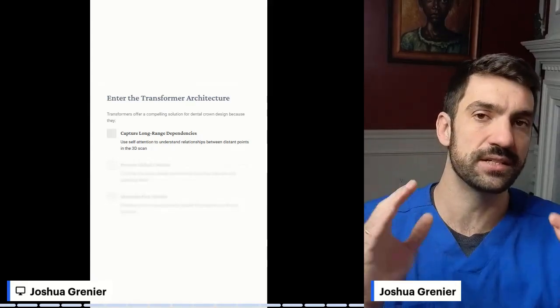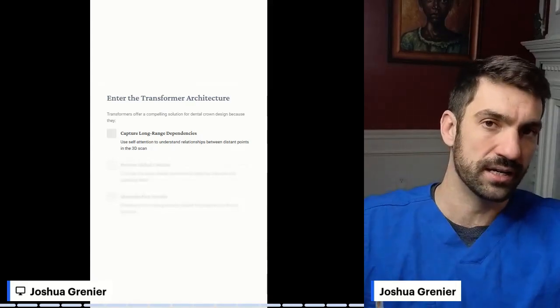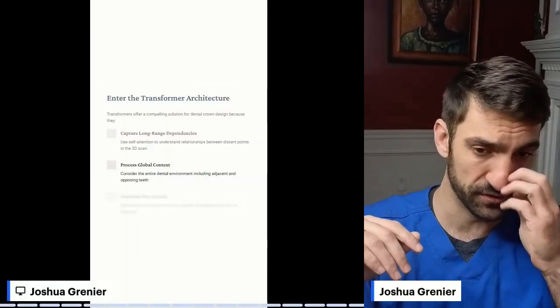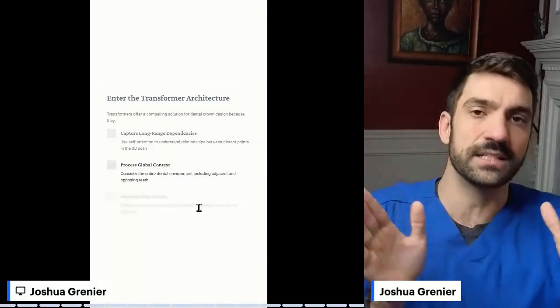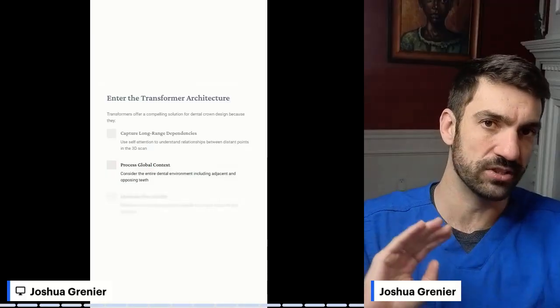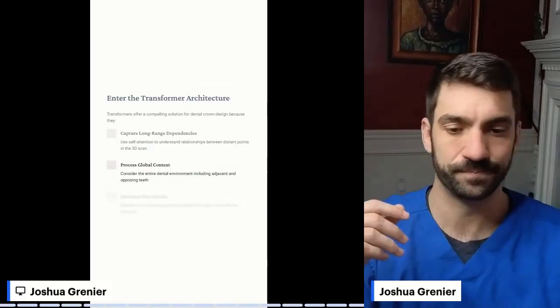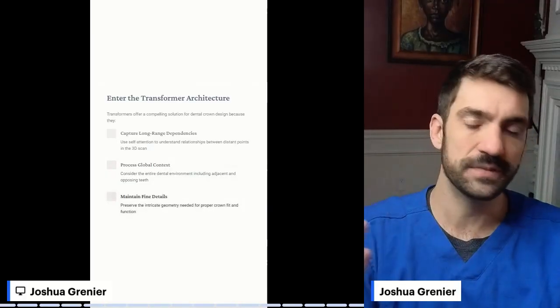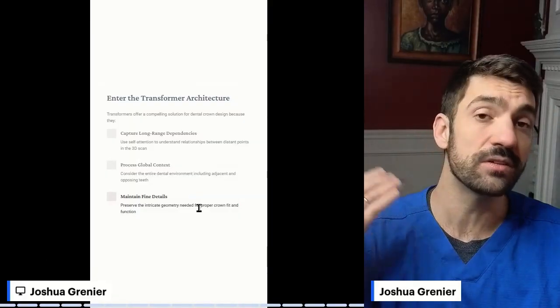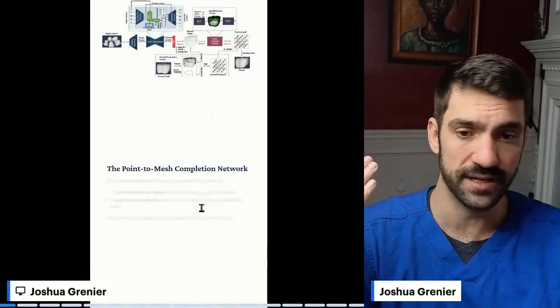So they can, in theory, create a crown that's harmonic to a very large area in a fundamentally different way than it's been created before. Again, they can consider and simply see things differently. So when they generate a crown, it's based on a plan. And they can perhaps generate finer details and, in theory, do a better job than what we have right now.